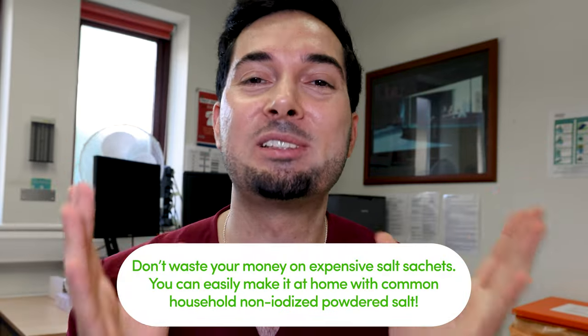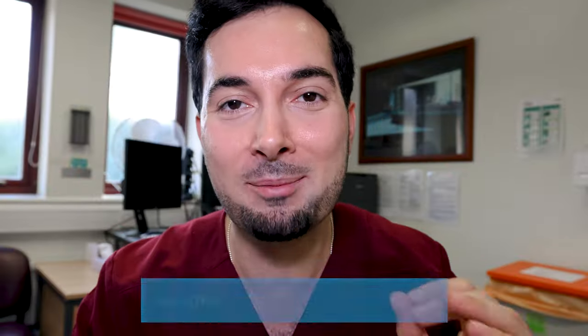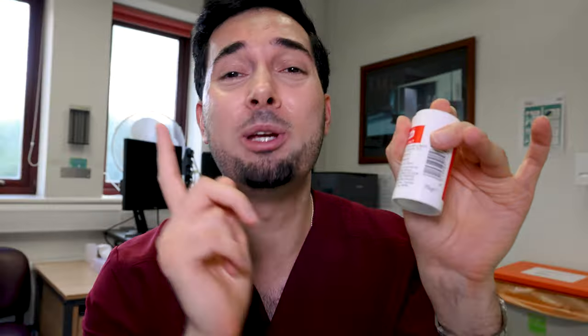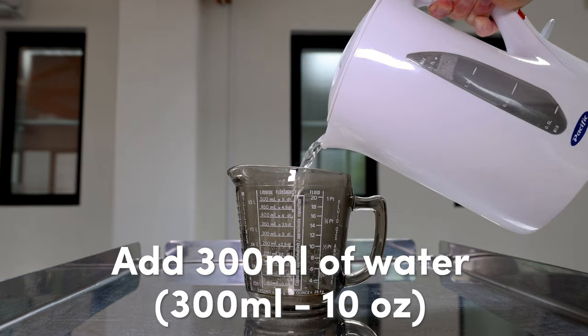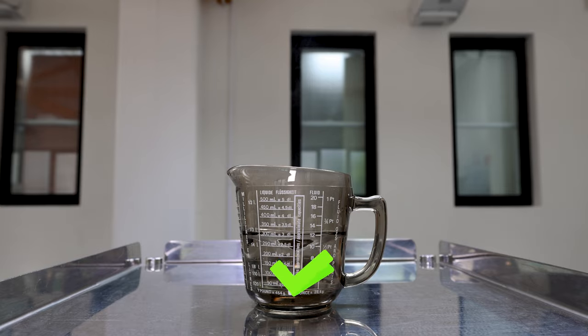Step one: do not waste your money on expensive salt sachets to make your saline solution. You can easily make your own at home with common non-iodized powdered salt. Here's how: boil water in a kettle, add one teaspoon of non-iodized powdered salt to 300ml of boiled water, mix, and your saline solution is ready.